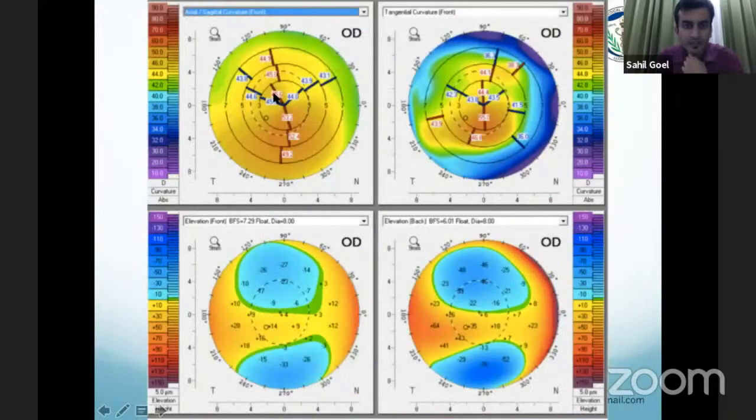And here, as you can see, 45.6, 53.2, there is high inferior superior asymmetry. This is one of the foremost criteria. Astigmatism with the rule most often will be normal. If it is with the rule, we mean that 90 degrees steep axis. If it is oblique or against the rule, that is sort of a red flag sign.